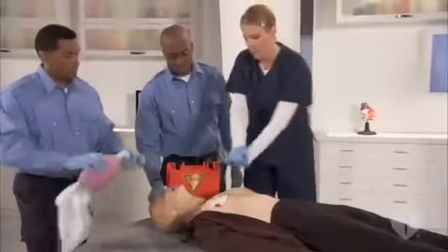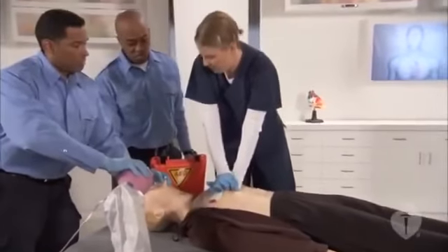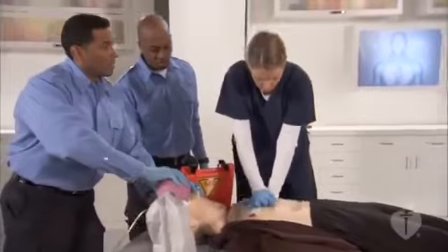Shock needed. Charging. Stay clear of patient. Deliver shock now. Press the flashing button. Shocking now on 3. 1, 2, 3.